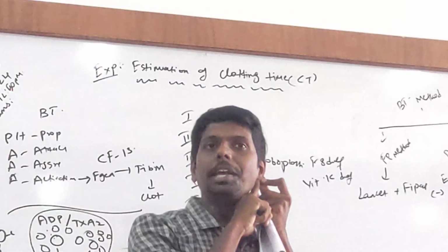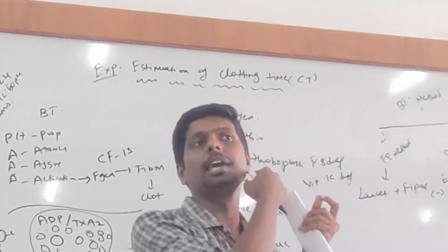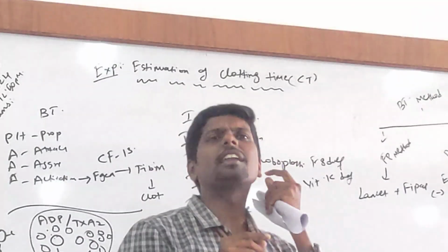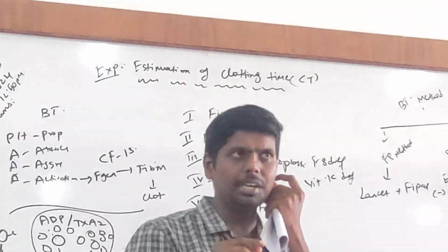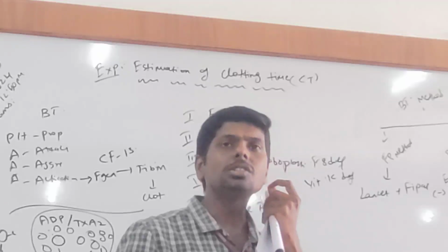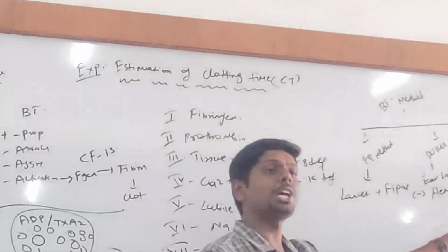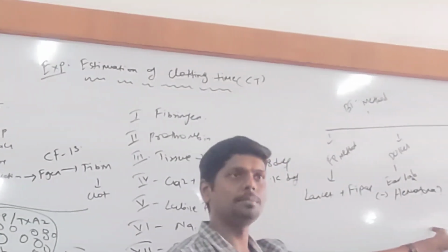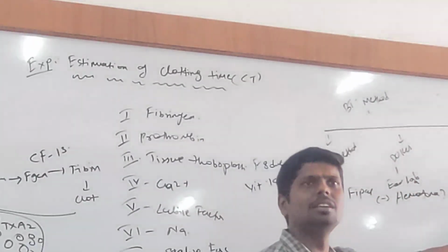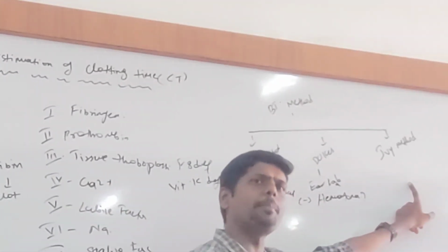The blood will bleed under the skin. It will make an internal bleeding. There will be a reddish hue to the skin, eventually becoming black. That is called hematoma. The chances of hematoma are very high. Okay, very good. Then what is this IVY method? What is the location of the IVY method?